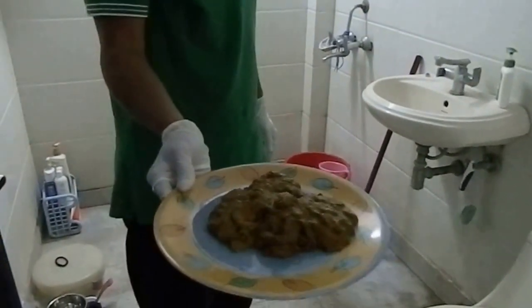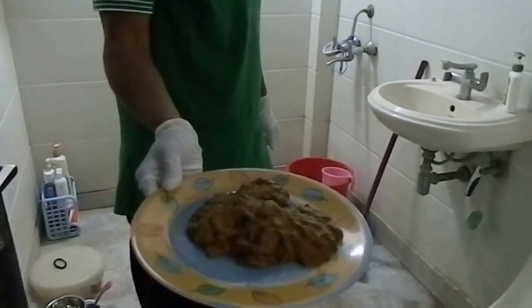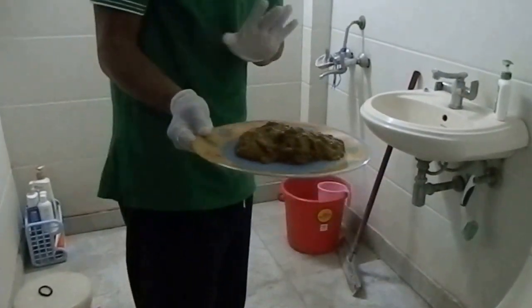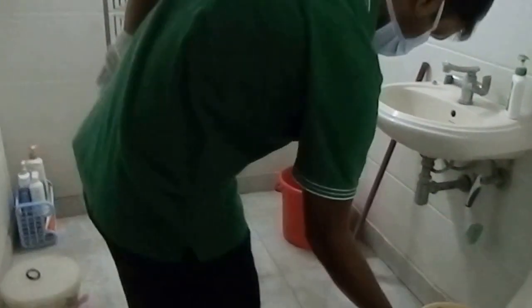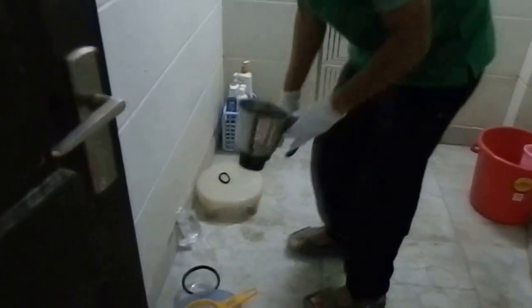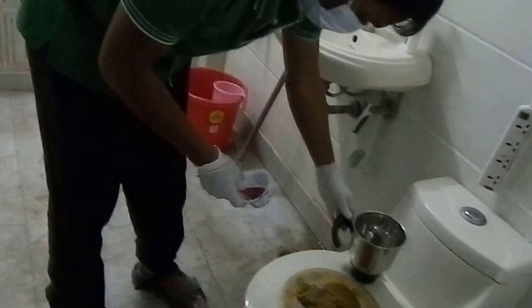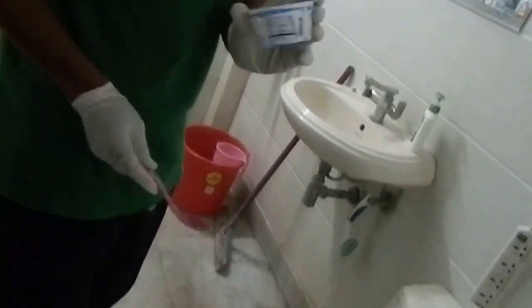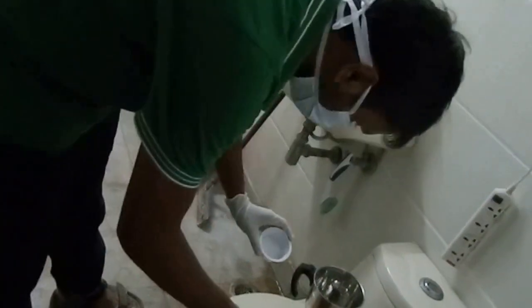The fecal matter is taken out. This is not 250 grams — this is the whole thing. Now we have to evaluate it. We are going to begin the measuring process. This is a 90 gram container, so we will take 3 scoops of it which is approximately 250 grams.